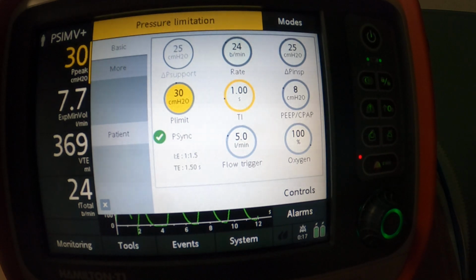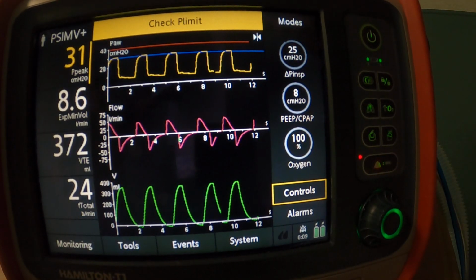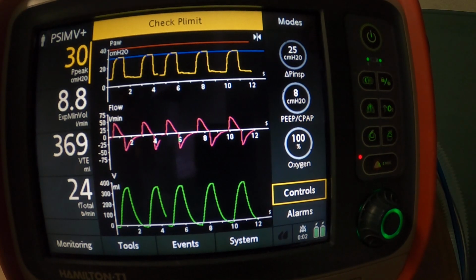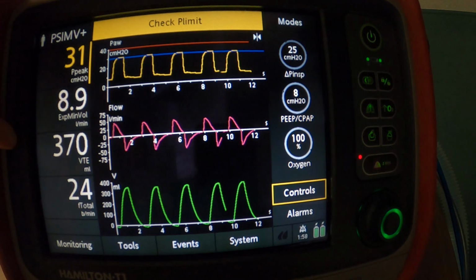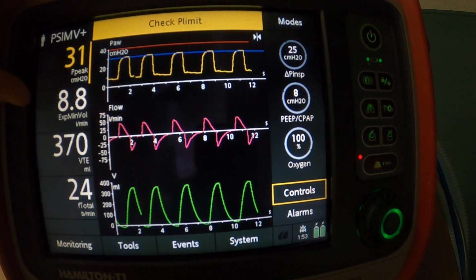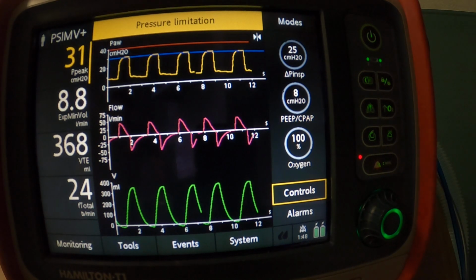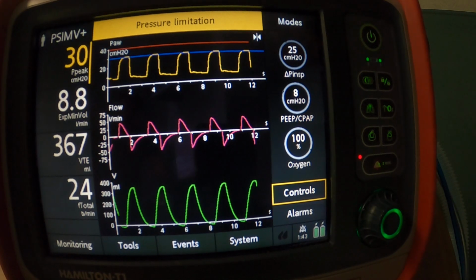Now try to squeeze that same amount with your bag valve ventilator in as quick as you can. It is a lot harder. You're going to achieve a higher pressure quicker. It's going to cause injury. It's going to cause problems unless you are like our vent and have a pressure limit. Now see, just by doing that, we increased both our tidal volume and our minute volume. Again, we already have a high respiratory rate, so respiratory rate times tidal volume equals minute volume.